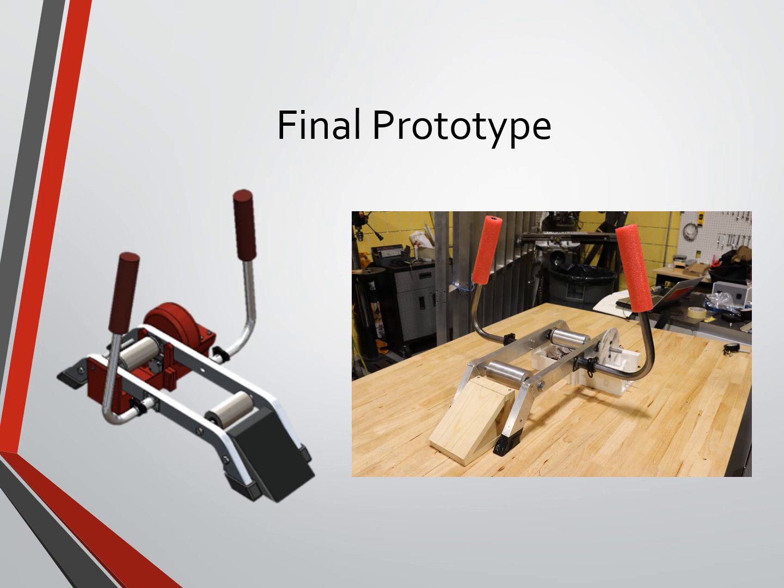The things we would change or improve if we had more time are the phone app interface and adding some additional user features. The programming as a whole could have used more time to iron out the kinks and make sure everything is running as smoothly as we would like. We also would have liked to incorporate a fan that turns on or off depending on the user speed or resistance, and the ability for an incline adjustment to raise the front of the bike, which would add to the realism of the trainer and allow the user to feel even more like they are riding a bike up a mountain. Both are doable additions if there was a bit more time for this project.